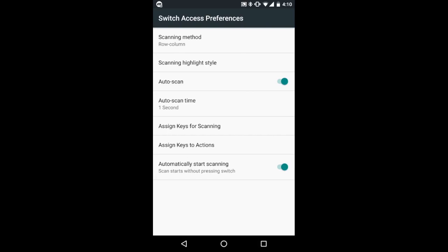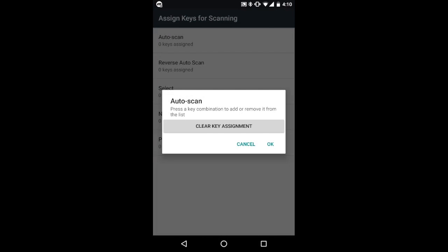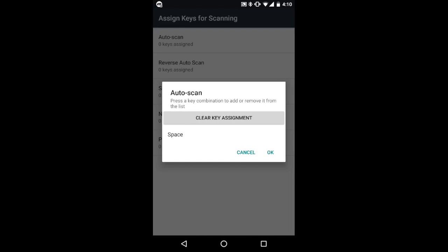Next, go to assign keys for scanning and select auto scan. When the auto scan pop-up appears, press the switch that is connected to your Tecla and click OK.